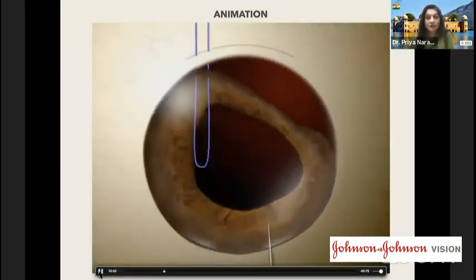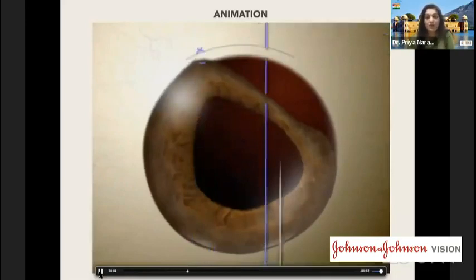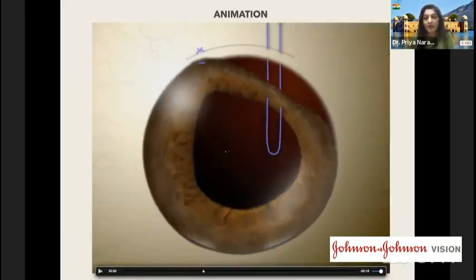We have taken a double arm suture and it has passed through the periphery of the iris. It is very important to consider the amount of iris tissue that you engage with the needle. You need to do this through the entire circumference of where you have an iris disinsertion. Whenever you're doing this, this iris tissue might be fragile.